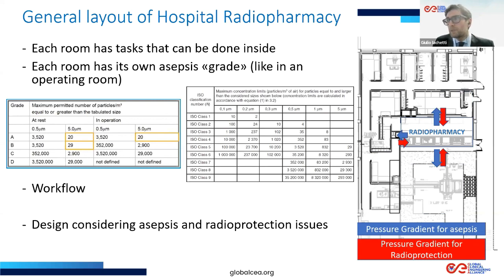So typically in the layout, and particularly in the design of the HVAC system, you solve this kind of problem with particular aspects and technicalities that are related to little rooms that can be a sort of boundary for the control of the pressure. Okay.